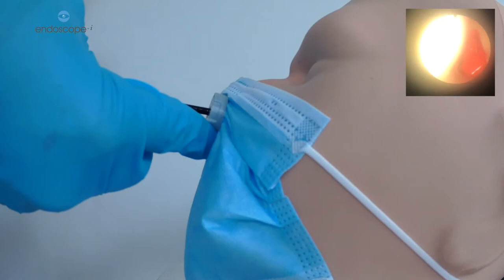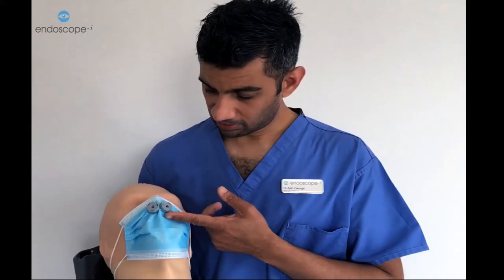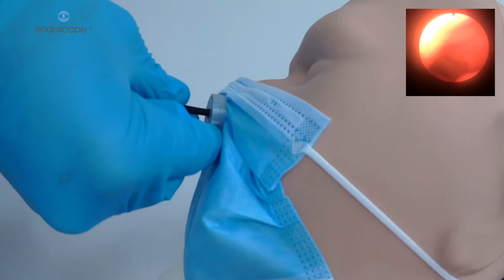At that point, you're ready for the third and final stage, which is lifting up the whole of the scope. You place your index finger just underneath the outer aspect of the valve and just lift up. This straightens out your pathway to pass the scope all the way through along the floor of the nose.